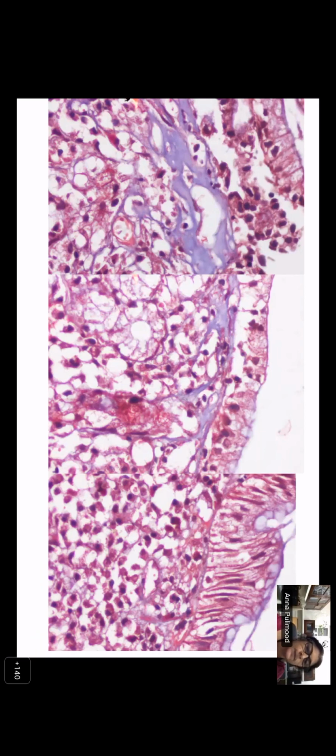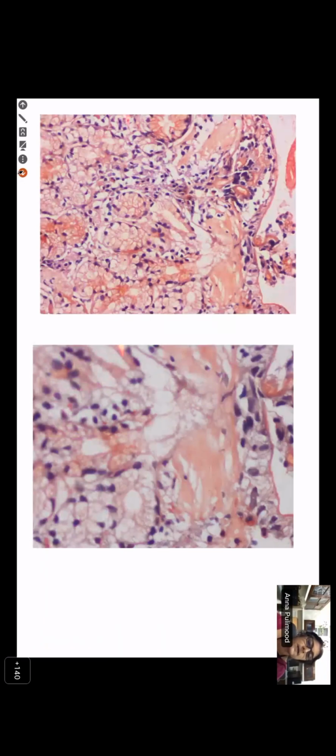What is the size of a normal RBC? 7.2 micron. About 7 microns. Okay. So you look at an RBC in the field and you see how many RBCs this will make up. Will this make up 10 RBCs, 20 RBCs? Yeah, maybe 10, 20. Okay. So definitely it's more than 10 microns, right? So now you know there's a subepithelial collagen band. Looks like collagen. We'll also look at the Congo red stain. This is Congo red stain. Is there anything special about this band? What color should it be in Congo red, if it is amyloid?